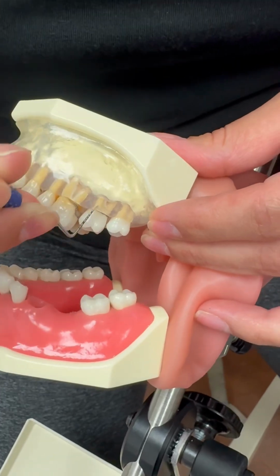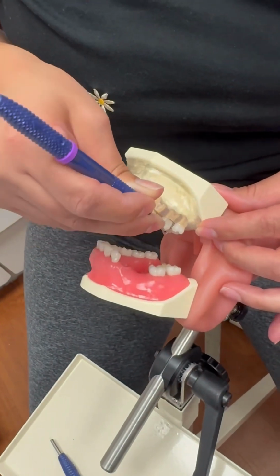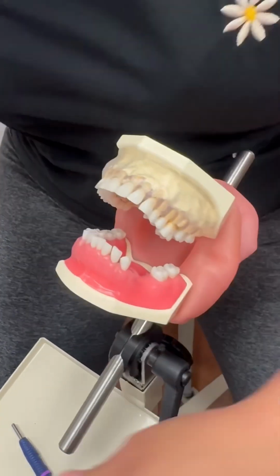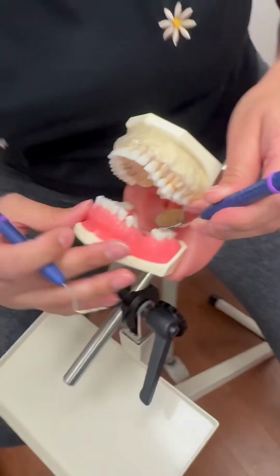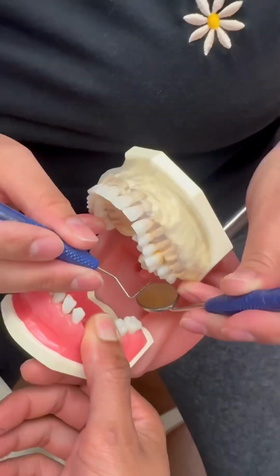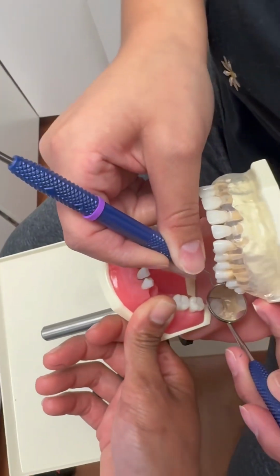Once we finish with the upper arch, we pass to the lower arch, and we start on tooth number 32 on the buccal surface to tooth number 17 on the buccal surface, and return from 17 on the lingual surface to number 32 on the lingual surface.